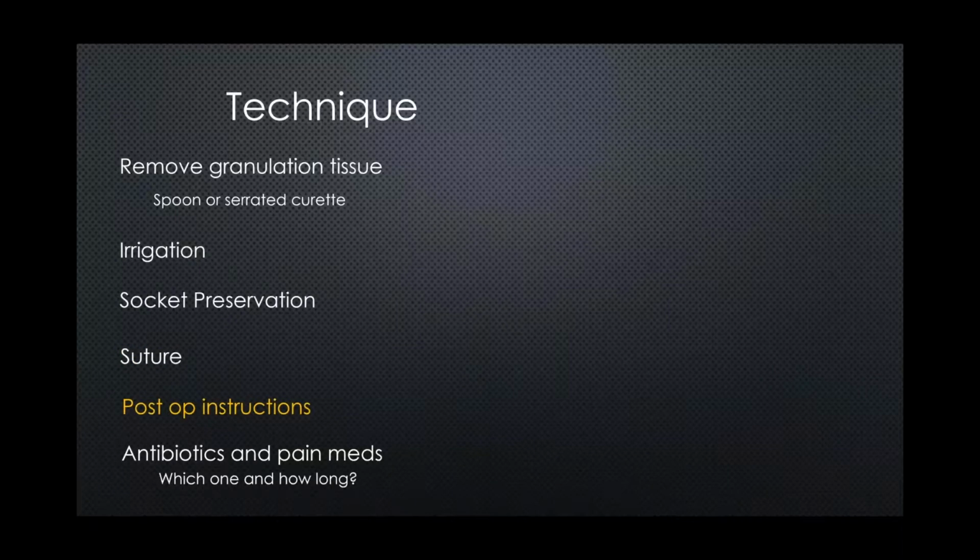Postoperative instructions, typically what we do is we have all our instructions printed out. We go over the instructions with our patient. We give a copy to the patient, or if the patient has sedation, we give it to the family member who comes with the patient. We also have them put on our website.